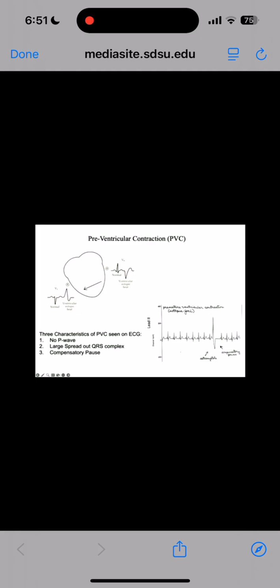Now, as I said to some of my groups this week when we do ECGs on one another, I'd be absolutely shocked if there weren't at least probably 3 or 4 people in here who had a PVC. They are common. There is nothing medically known wrong with them. Unless you start having one after another very consistently, then a cardiologist would want to know why.